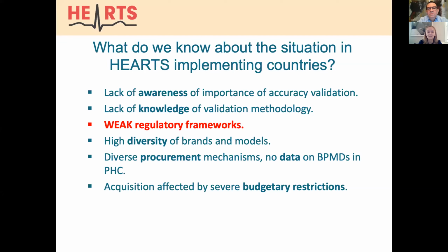Basically, what is validation for accuracy? That's what Dean explained so well. So healthcare workers, physicians, nurses, and managers of health programs, many of them are not aware and do not know how a validation study is conducted and what it leads to.